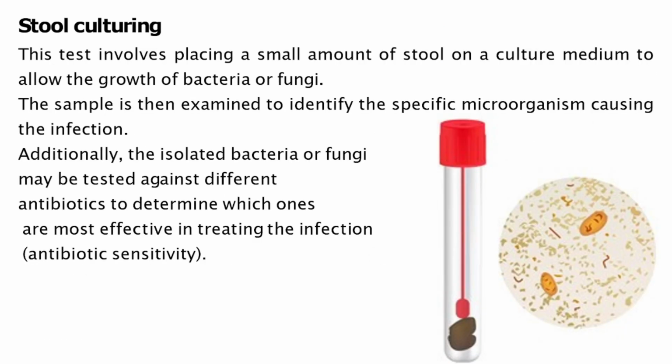The next one is stool culturing. When the stool sample is safely and properly transported to the medical laboratory, what do the medical technologists do? They perform various methods to identify the infection or any type of health condition of a patient. The first is stool culturing.